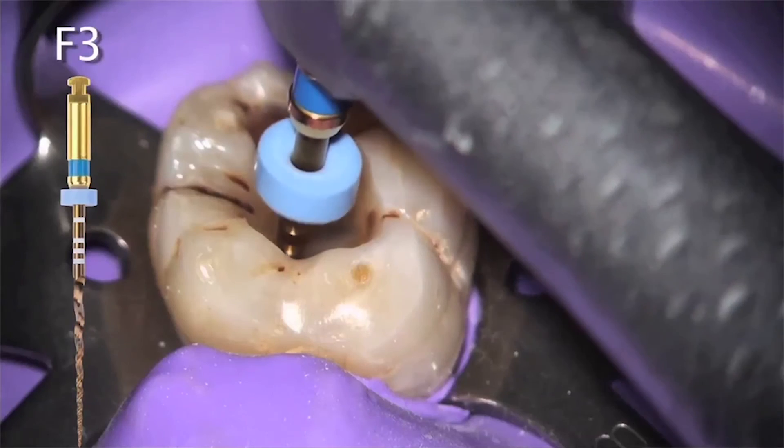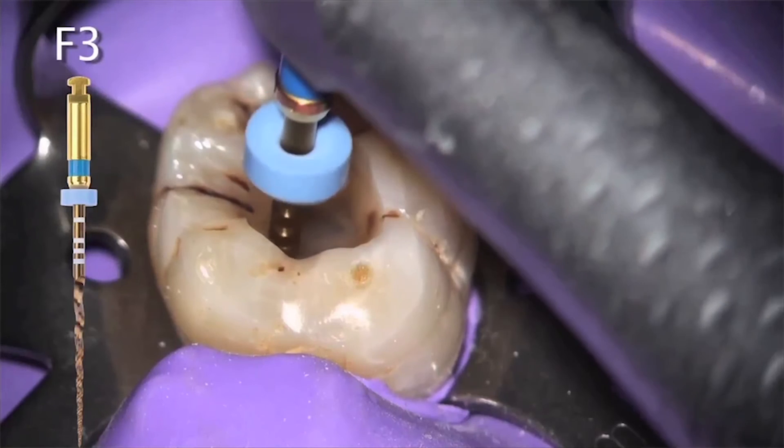More flexibility allows the ability to refine the mode of use. It's very easy to understand: brush and follow for shapers; follow, brush, and paint for finishes. With the first file, we use a strong outstroke motion away from the furcation in order to create more space. This allows the file to move passively deeper without any pecking action. With finishes, the motion is reversed — the file should follow the path of the canal and then a soft painting action is made to help the file safely advance.